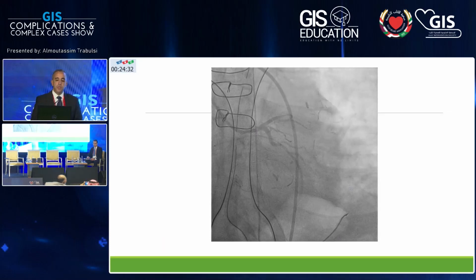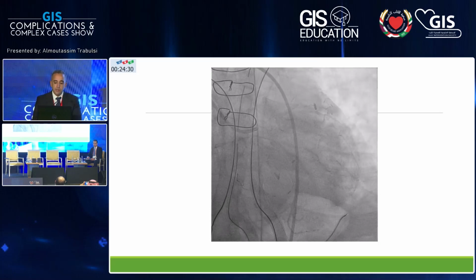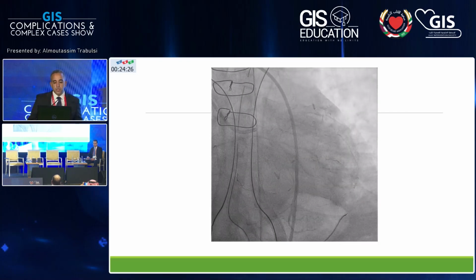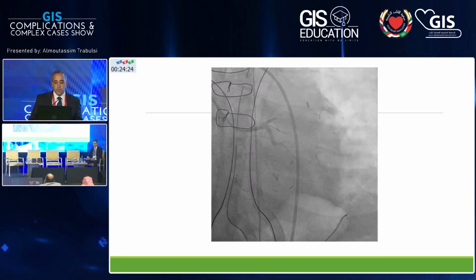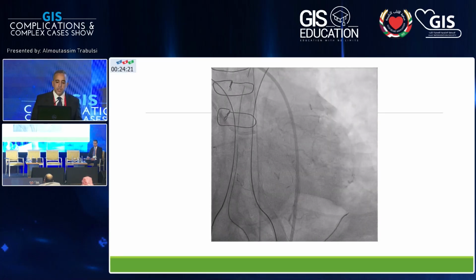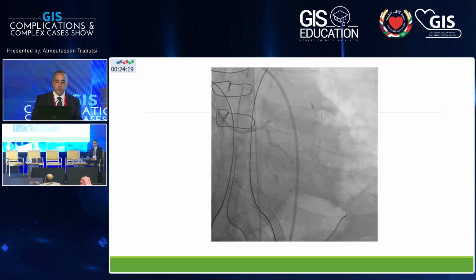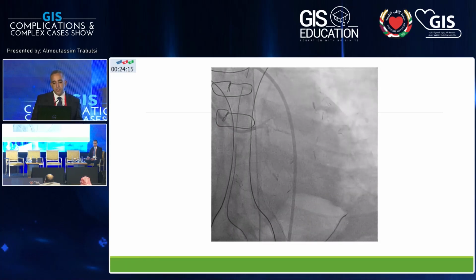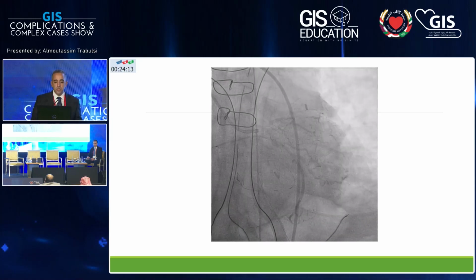So we took him back to the cath lab, and immediately we obtained access in the right common femoral artery. His diagnostic showed stable anatomy in terms of the left native system on the caudal pictures. The LAD is less visible at this stage compared to his last images.